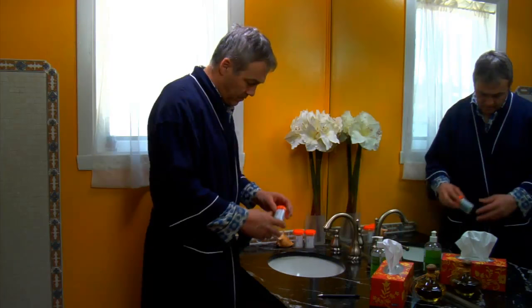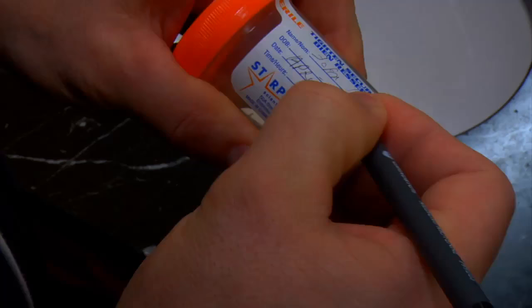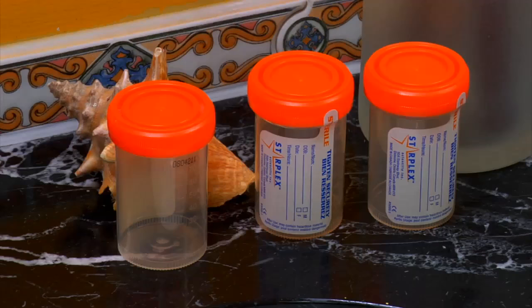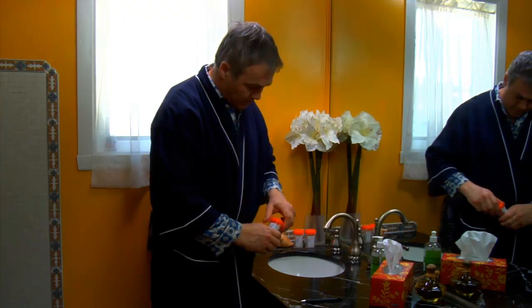On the bottle, write your name, as well as the date and time the sputum sample was collected. Remember to use a different bottle each day.